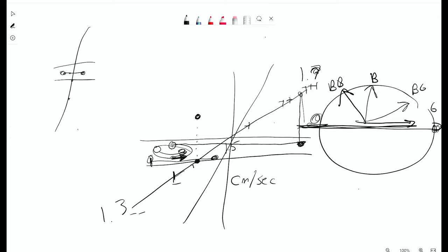Right? Because in this case, you see what I mean? If it's going up, it's getting a positive phase shift, then you're actually going to see a signal drop off because it's not going head to foot, right. It's going A to P. So you'll see it drop off here. What we do instead is we say, I don't care about the phase information now, just give me the magnitude image. Okay. You know what I mean? So just give me bright, bright, bright.